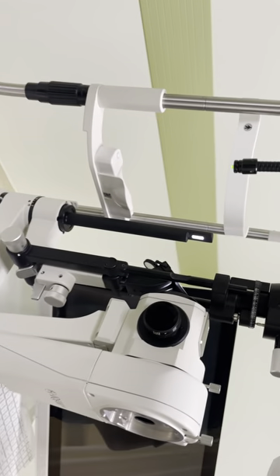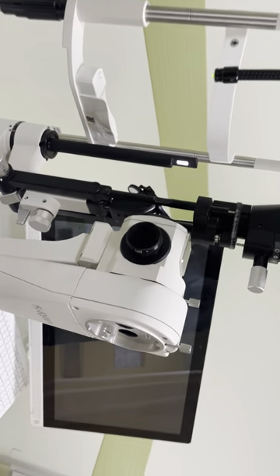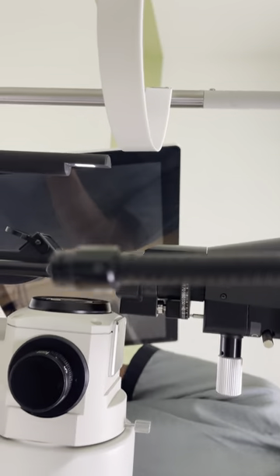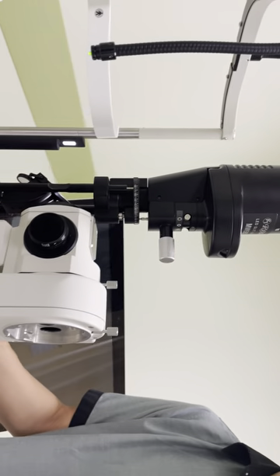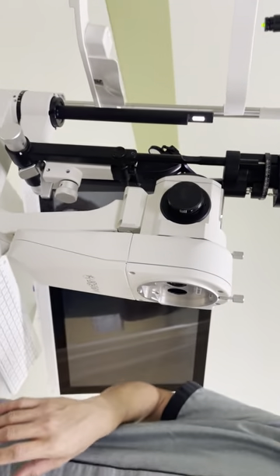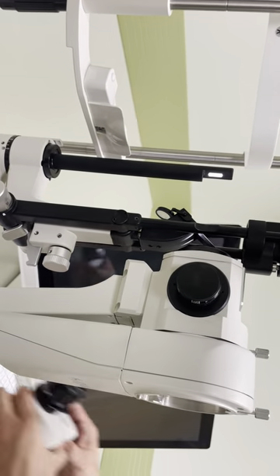We can clean all the lenses, but here we need to be more careful. Use the solution — I can help you mix it. Don't use pure alcohol because of the coating; it may cause stretching over time. Thank you.